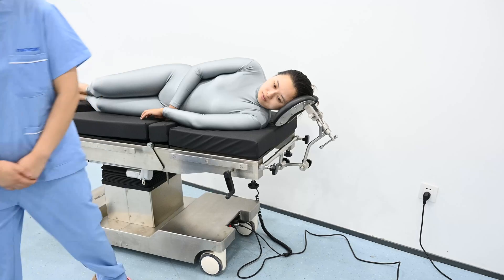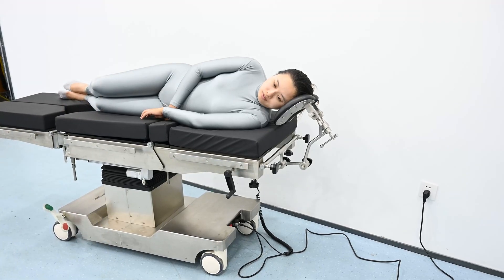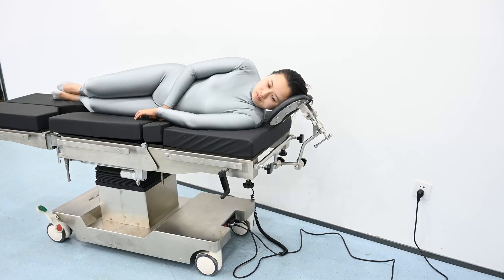Then we are going to install the double layer arm rest on the operating table and place the patient's hand on it.